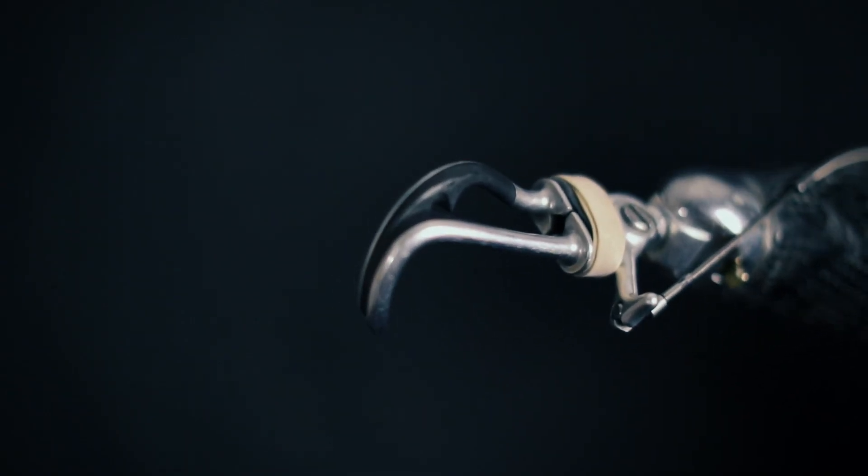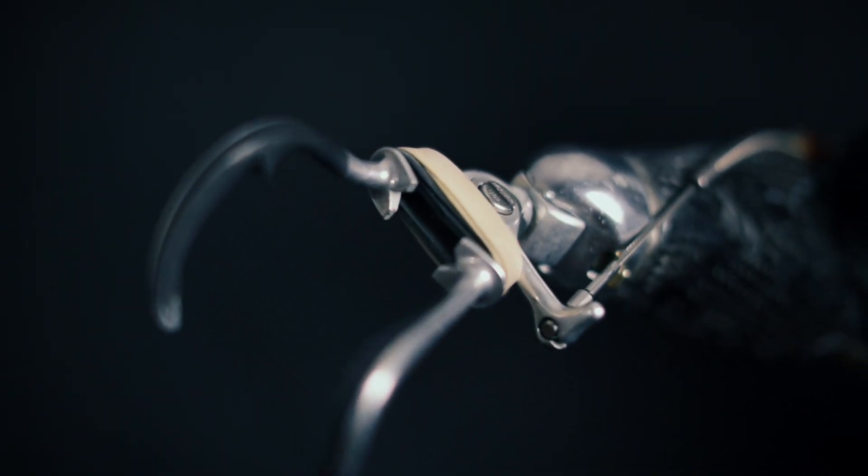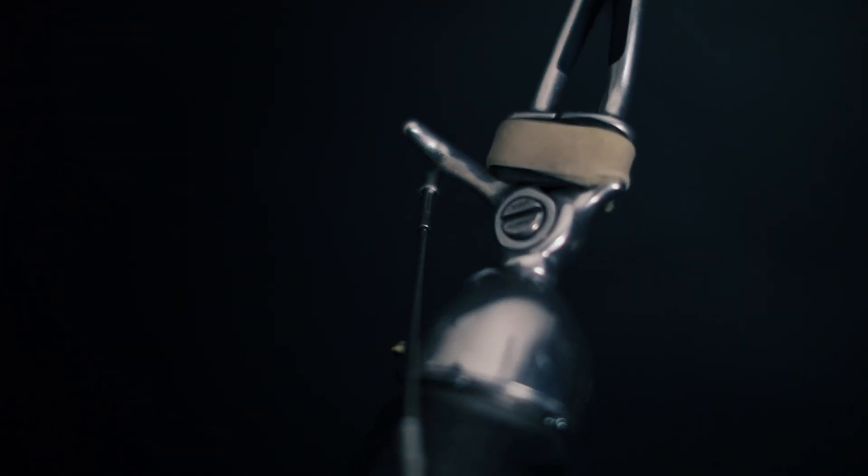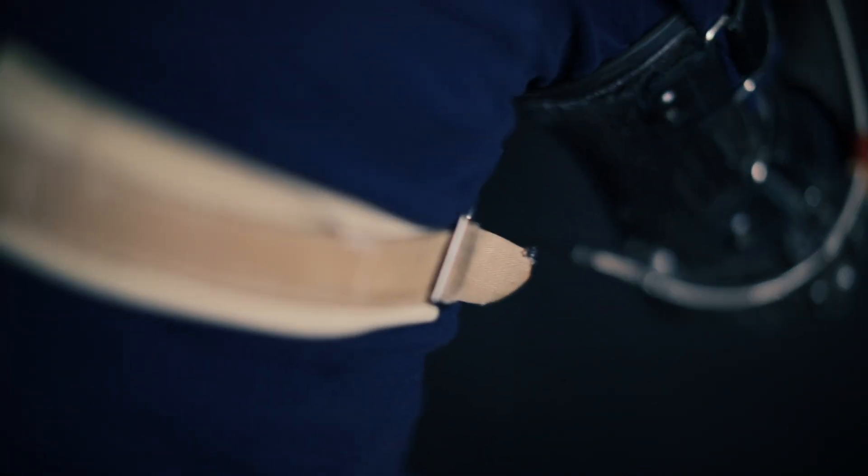The main hook on the end of each arm is made up of two parts, which are held together by rubber bands, making the hook closed by default. To open the hook, a cable not dissimilar to one you'd find on a bike is connected to the inside hook and then straps up all the way around my back and connects to a harness.